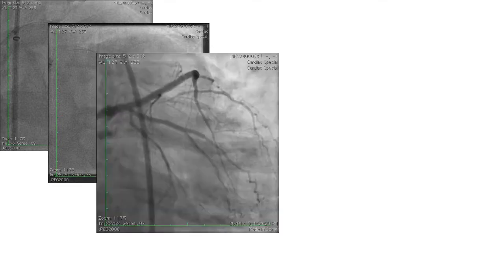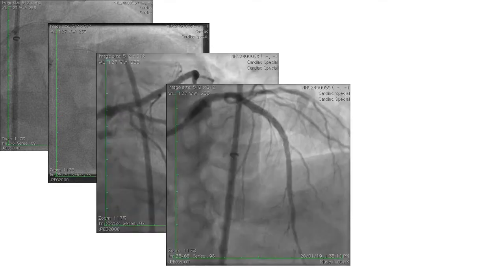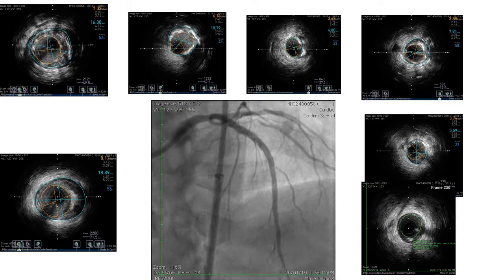I post-dilated the distal stent with the 2.5 as well as 2.75 NC, then the proximal stent and overlapping with 3x15 and 3.5x15, and you can see these are the final diameters or final areas which I got after post-dilatation. The distal reference was around 3.5, the distal stent was almost 3.7 to 3.9 mm square, and the proximal stent almost 6 to 8 mm square.